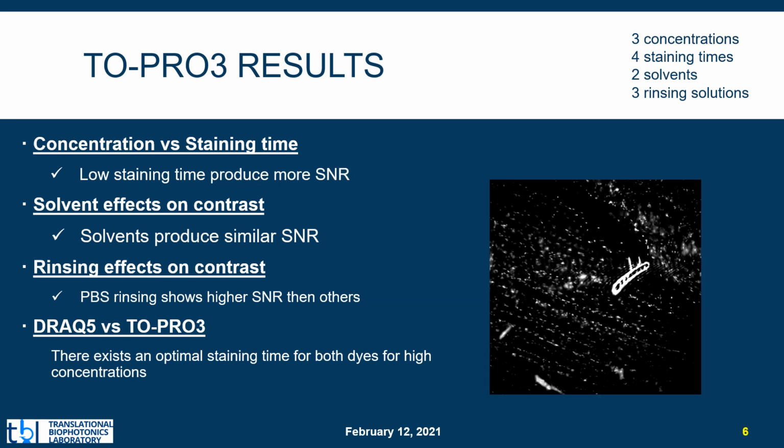We also note that TO-PRO-3 can be taken up by non-biological materials such as tissue fibers or other contaminants, resulting in very bright artifacts such as shown here.